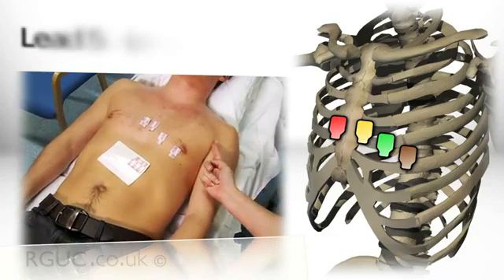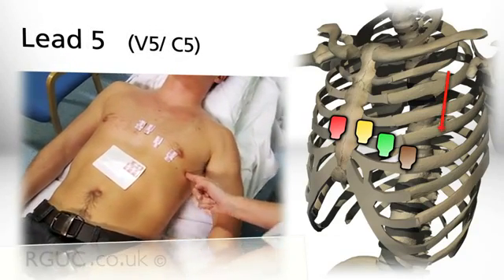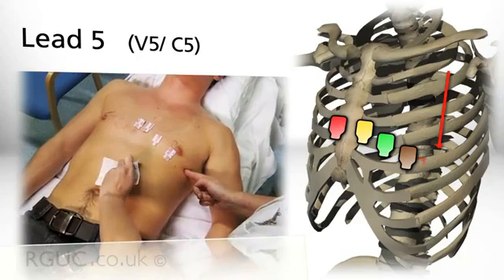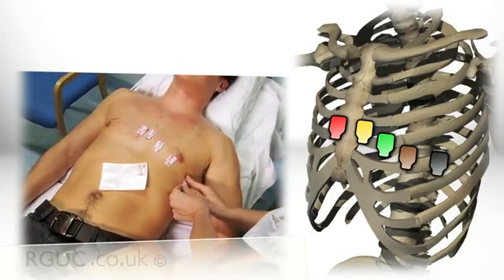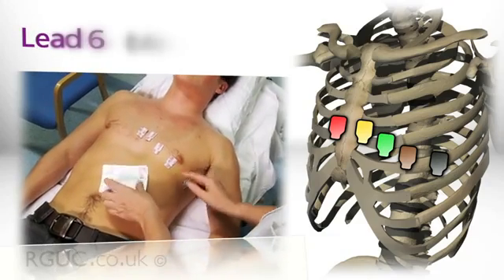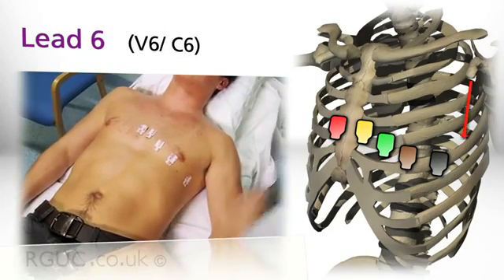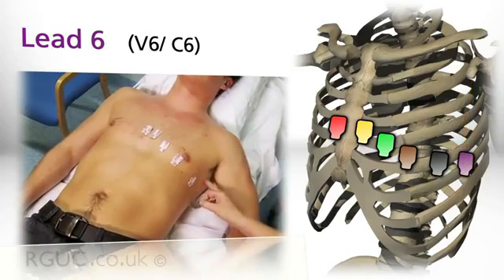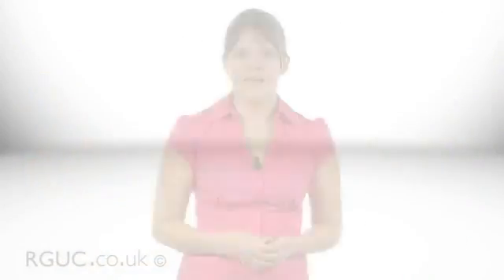For lead five, labelled V5 or C5, the electrode is located at the left anterior axillary line on the same horizontal plane as V4. For lead six, labelled V6 or C6, the electrode is located at the left mid-axillary line on the same horizontal plane as V4 and V5. In women, the electrode should be placed underneath rather than on top of any breast tissue.